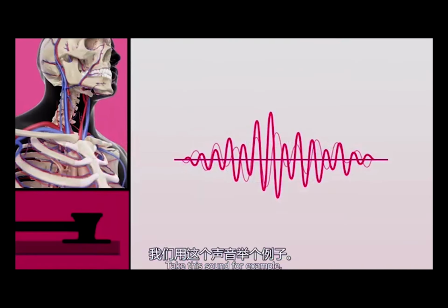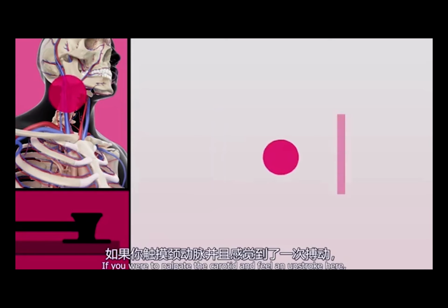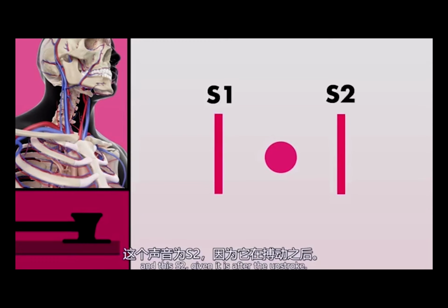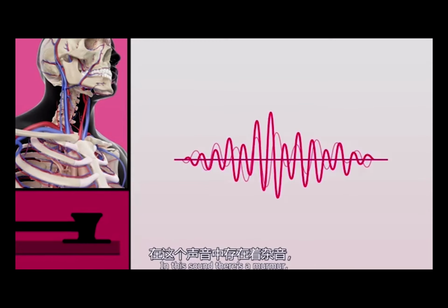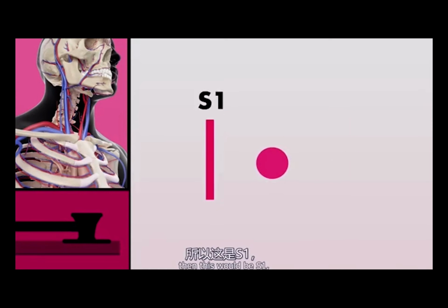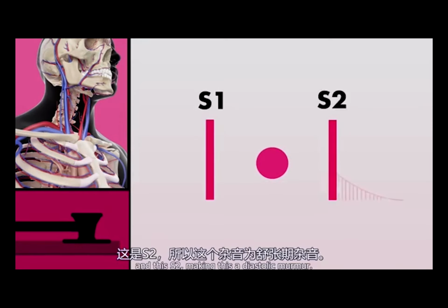Take this sound for example. You hear the rhythmic alternating of sounds, but which is S1 and S2? If you were to palpate the carotid and feel an upstroke here, then you would label this S1, since it's before the upstroke, and this S2, given it is after the upstroke. In this sound there's a murmur, but is it systolic or diastolic? By identifying S1 and S2, you can narrow the murmur as either being systolic or diastolic, and from there narrow your differential diagnoses as to what might be causing the murmur. In this case, the carotid upstroke is felt here, then this would be S1, and this S2, making this a diastolic murmur.